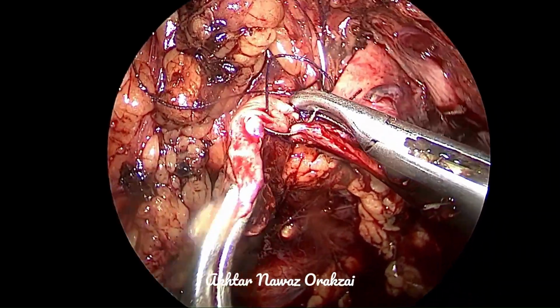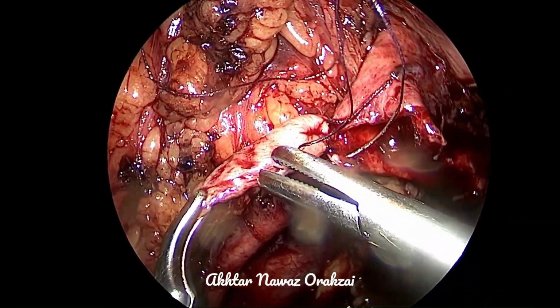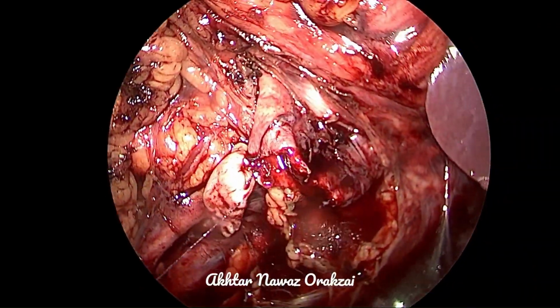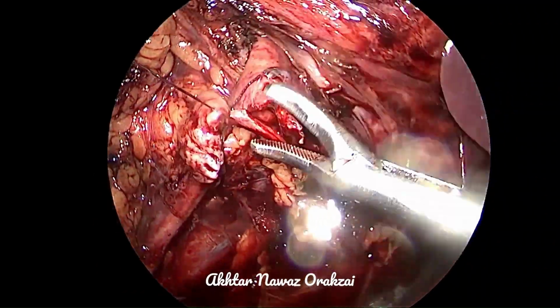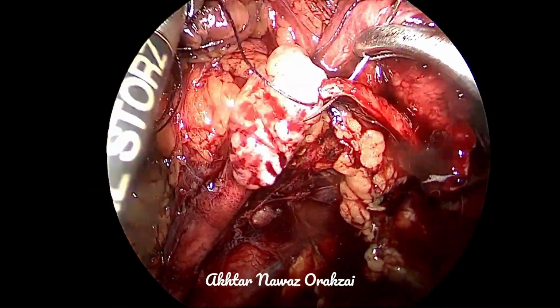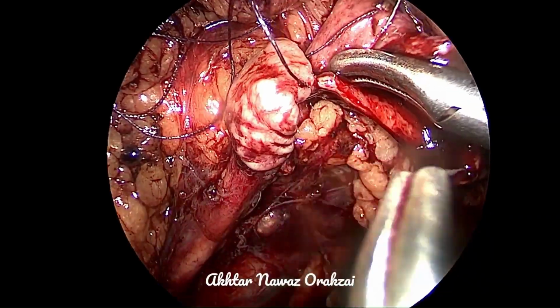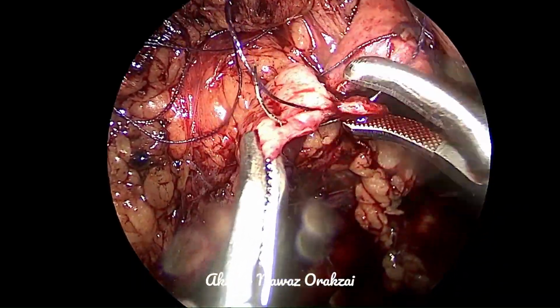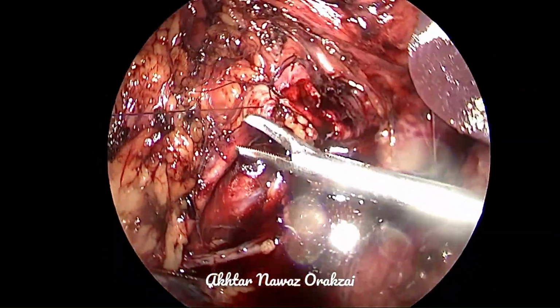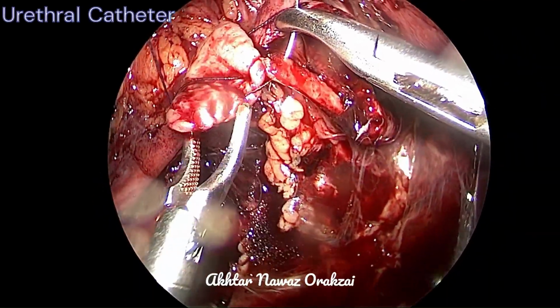As we all know, surgical manipulation would create edema of the anastomotic area for a minimum of 72 hours. So during that period of edema, there is a chance that this area may get obstructed and the anastomosis will be disrupted. There will be urinary leak, and hence the pyeloplasty may fail. So during that period of edema, if we place a stent, that stent is usually helpful.